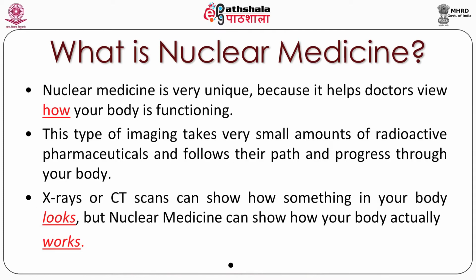Nuclear medicine is very unique because it helps doctors view how your body is functioning. As we defined on our previous slides, the other imaging techniques are there, like X-rays, CT, MRI. Then why is nuclear medicine there? We are emphasizing it because it tells about the functioning of the organs, the functioning of the body.